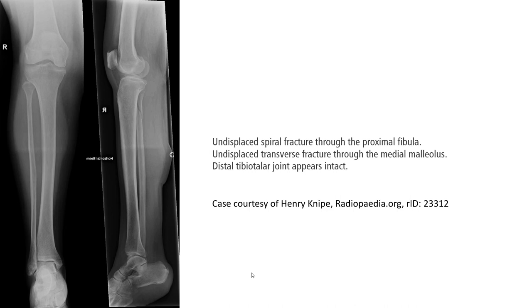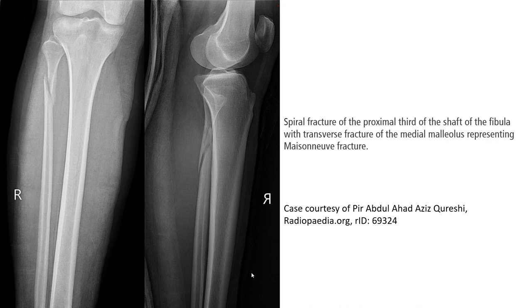This is called Maisonneuve fracture. Another example of Maisonneuve fracture: a displaced spiral fracture through the proximal fibula and a displaced transverse fracture through the medial malleolus. This shows a spiral fracture of the proximal fibula with a transverse fracture of the medial malleolus, representing Maisonneuve fracture.